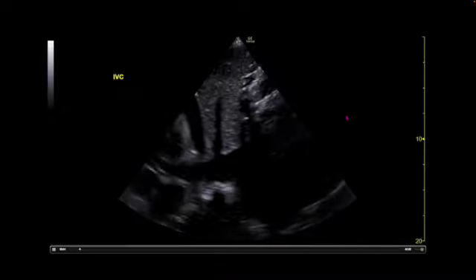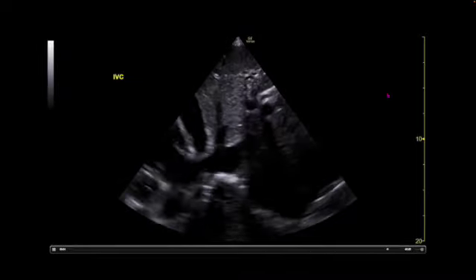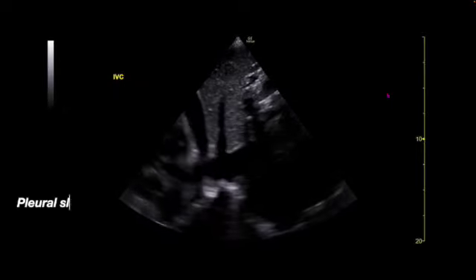Now, not very specific, right? Because people can have a dilated IVC for other reasons. In the majority of cases, 99.9999% of patients, they will have a dilated IVC. You might have a strange situation where somebody's so severely dehydrated and also has tamponade, or they're bleeding out and also has tamponade. Say somebody collapsed in their home and laid on the floor for 3 days as fluid accumulated around their heart. Yes, you could have a smaller IVC. But in the majority of cases with tamponade, they would have a dilated IVC.